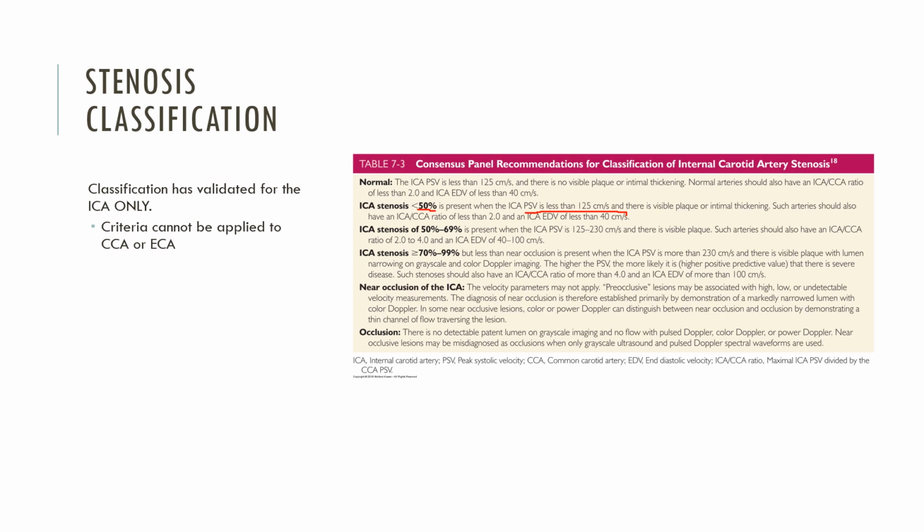Now, what makes this easy is if you have these values on that same tech worksheet that I mentioned, that you could put your history and everything else on, it makes this process of evaluating for classification of stenosis much easier. So that's highly recommended that you put together a really good worksheet that will make your job and your life much easier.